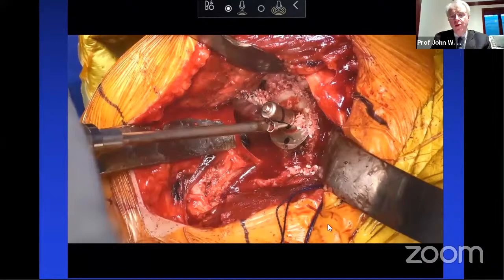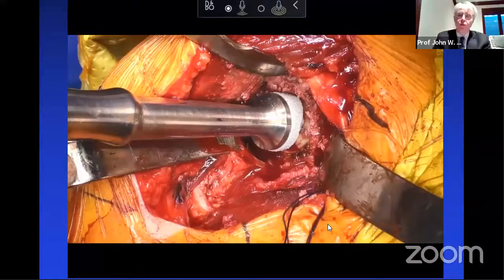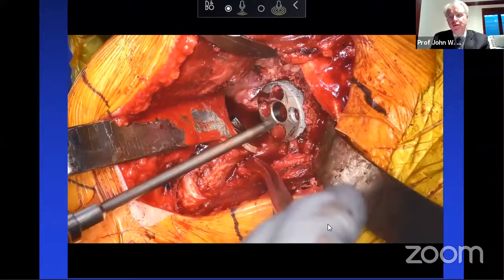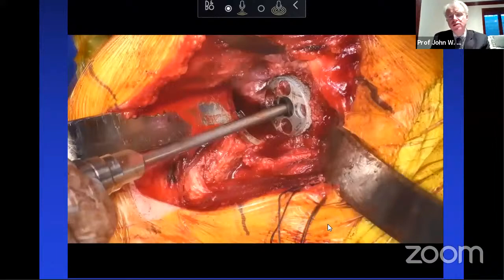And there's the augment. We'll go ahead and pound this in, and then we'll be able to go ahead and fix it down. And you'll see the compression we get. Some of us like a center screw, and you'll see the compression you get with that compared to a post. And then for me, I just put in 4 locking screws peripherally around there. So again, a simple technique. Once you see the whole scapula moving together with the base plate, you know you have absolute fixation in this case.